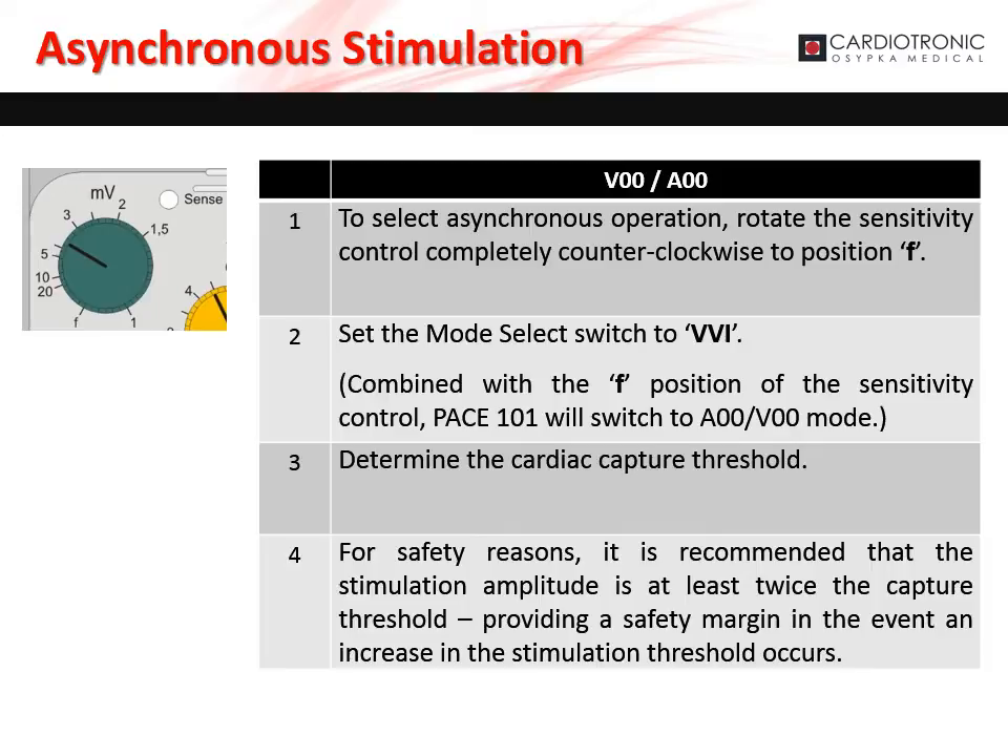To select asynchronous stimulation, rotate the sensitivity dial completely counterclockwise to position F. Set the mode dial to VVI. VVI mode combined with the F position on the sensitivity dial puts the Pace 101 in A00 and V00 mode. Determine the cardiac capture threshold and set the stimulation amplitude to two to three times the capture threshold — this provides a safety margin in case the capture threshold increases.